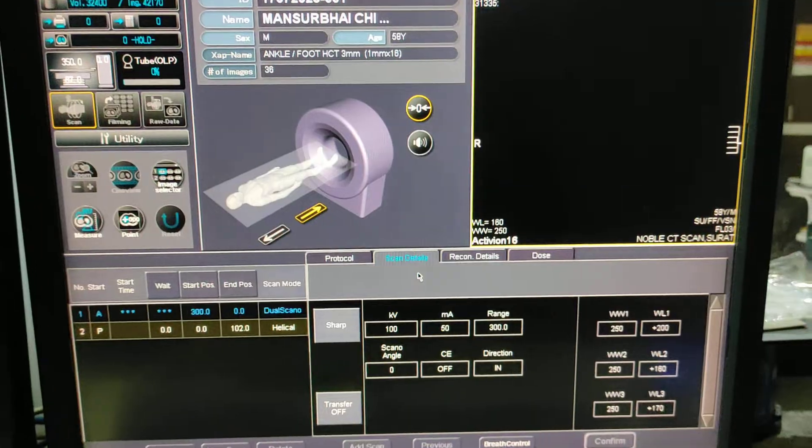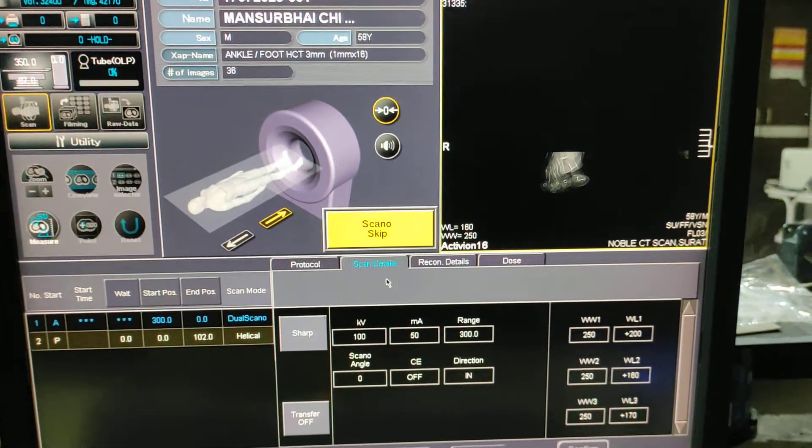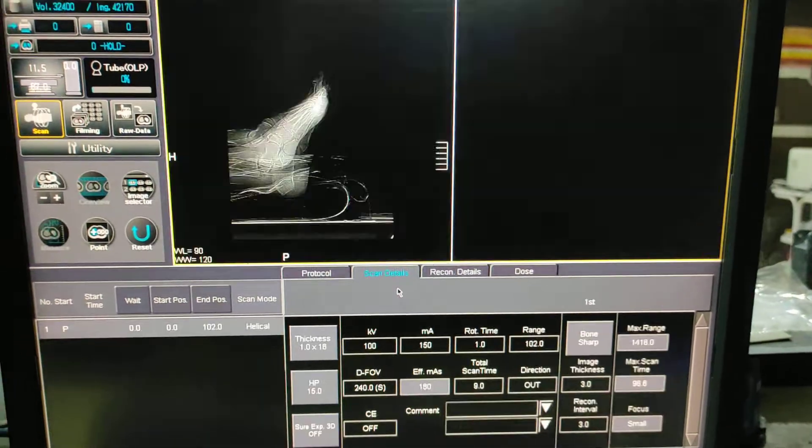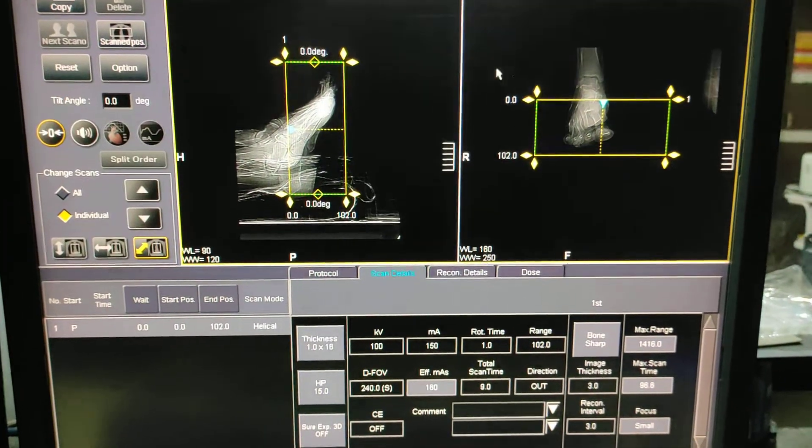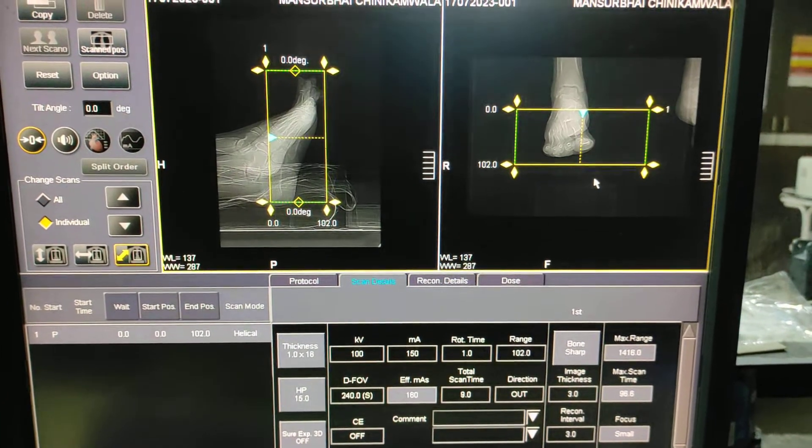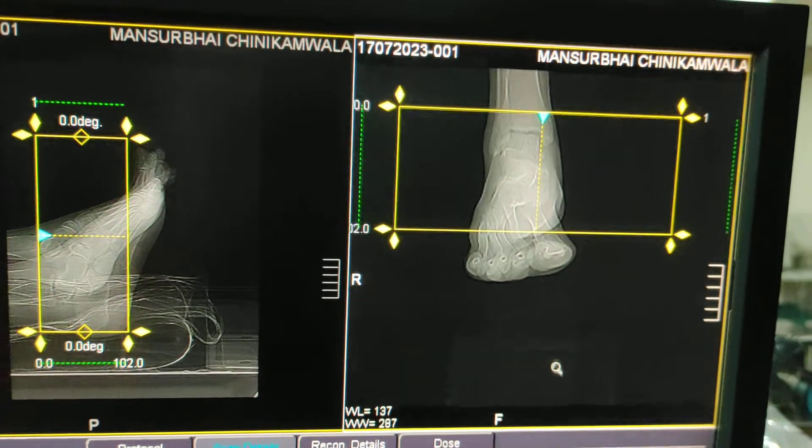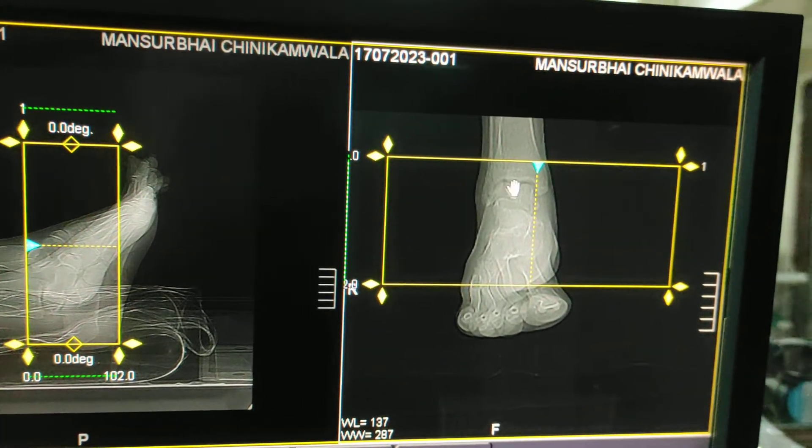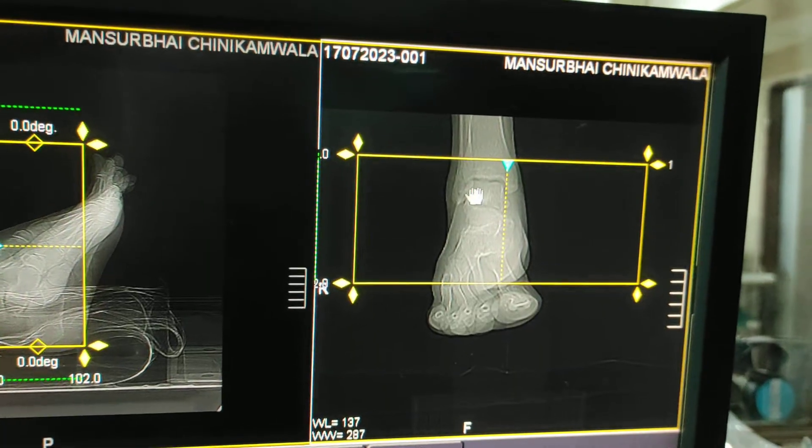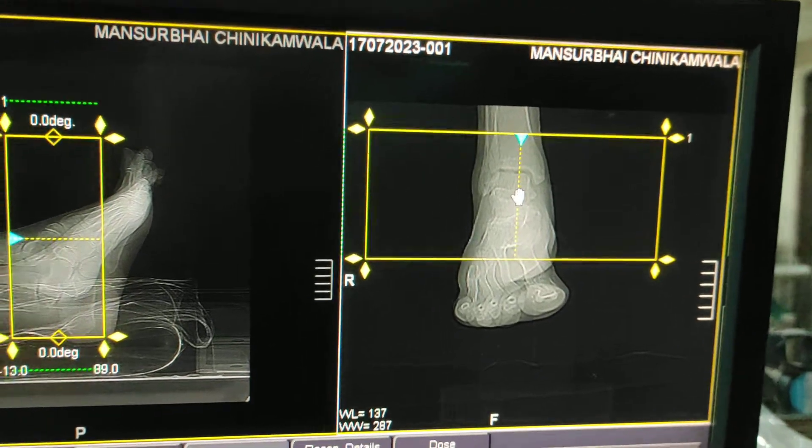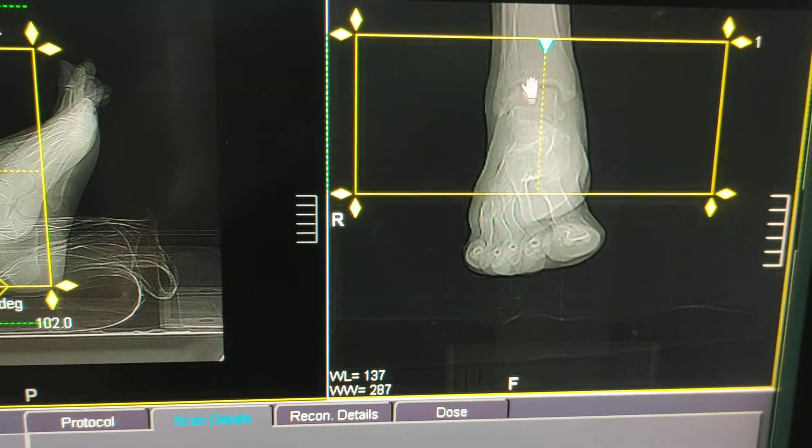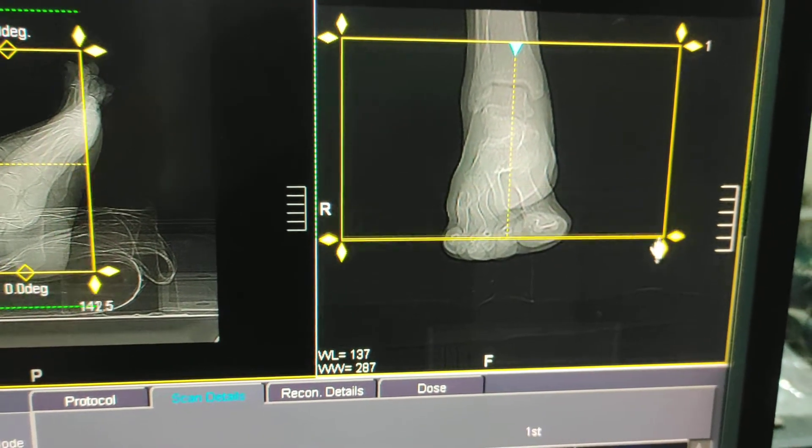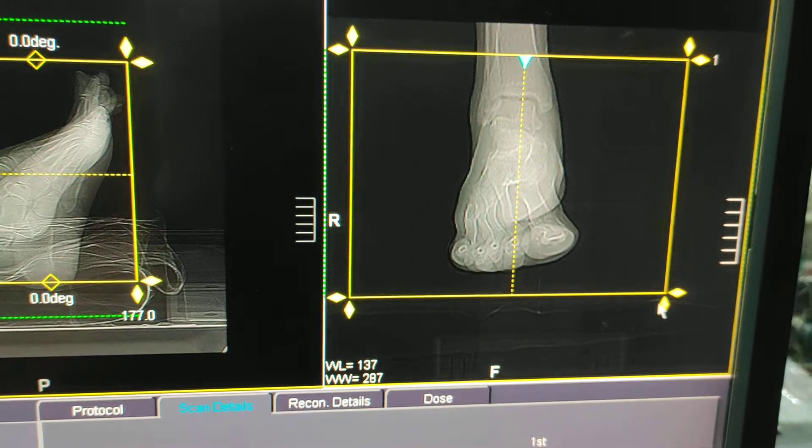In this case, we have to diagnose question mark osteomyelitis of the great toe. So in this scan, you have to take all of the foot. This is fibula, this is tibia, lateral and medial malleolus. You have to cover from lower end of tibia fibula up to all of the foot.